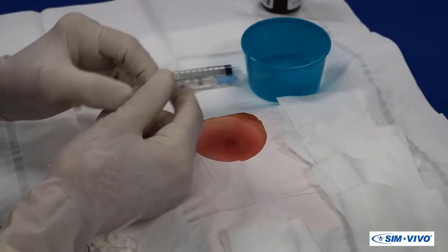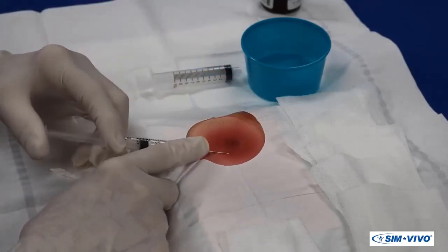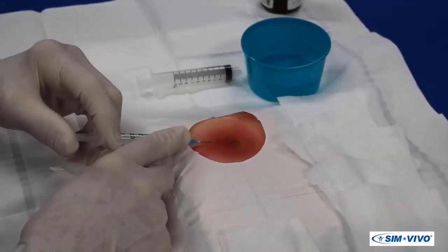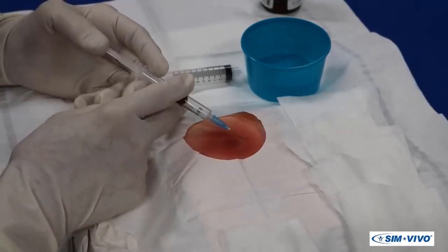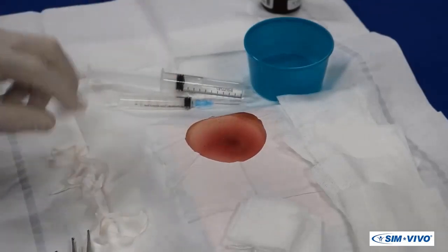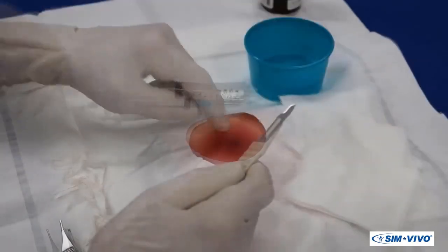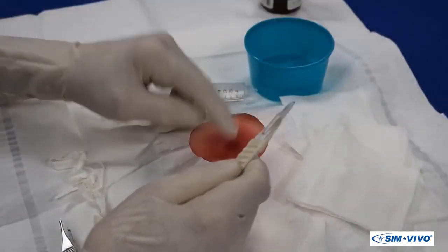However, some benefits may be derived from a field block around the proposed incision. For this exercise, we will fill the syringe with air as a substitute for lidocaine. Sequentially infiltrate the skin around the abscess. For convenience later, arrange all supplies and instruments for easy access.